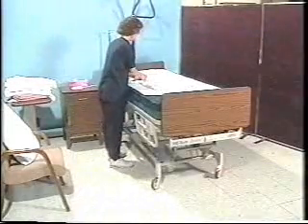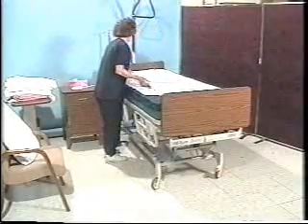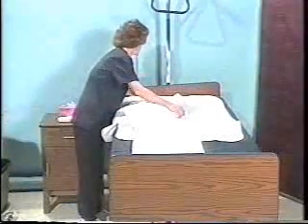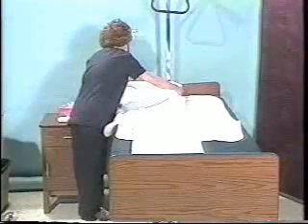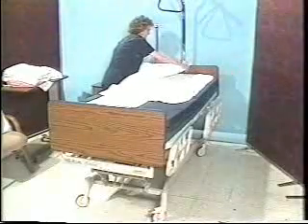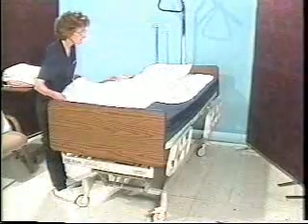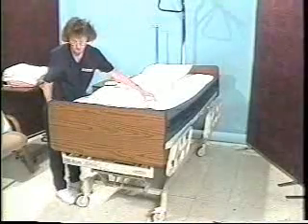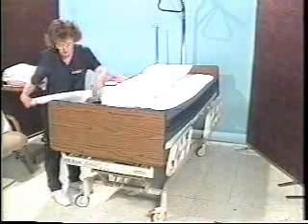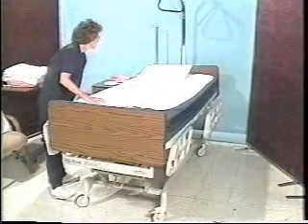The caregiver unfolds the bottom sheet so the center crease is in the middle of the bed and the bottom edge is even with the bottom of the mattress. The remaining length of the sheet reaches over the top of the mattress. The hem stitching is facing down. Hem stitching can be a source of skin irritation if it rubs on the patient's body.